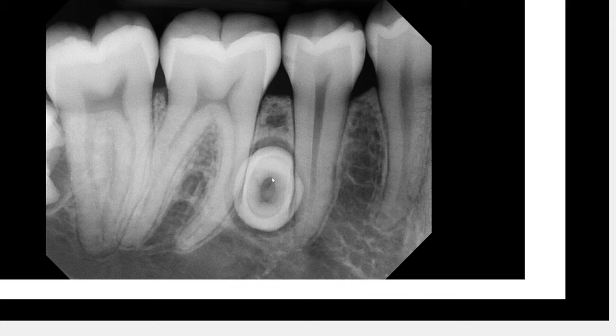At this point, you should really be thinking of a supernumerary tooth or an odontoma as your differential diagnosis — those two are probably the best options here. If this is a supernumerary, consider the angulation: you're likely looking at a horizontally positioned supernumerary, and what we may be seeing down the long axis of that tooth could represent the pulp canal of that tooth.